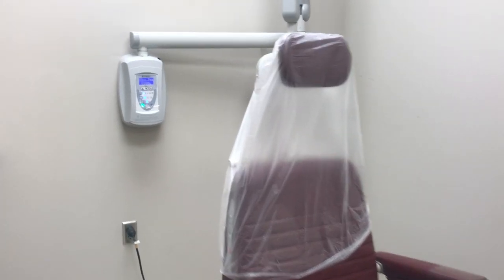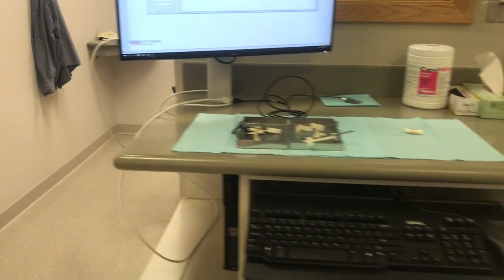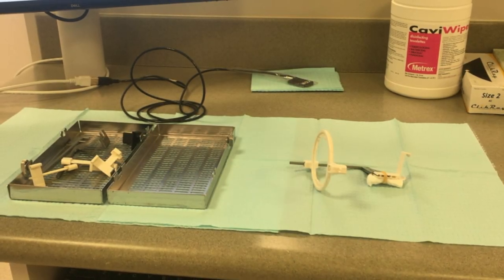Place a bag over the patient's chair and place barrier tape over the control panel. Put barrier tape over the mouse and X-ray exposure button. Retrieve a cassette, cotton roll, and rubber band for the bite block.